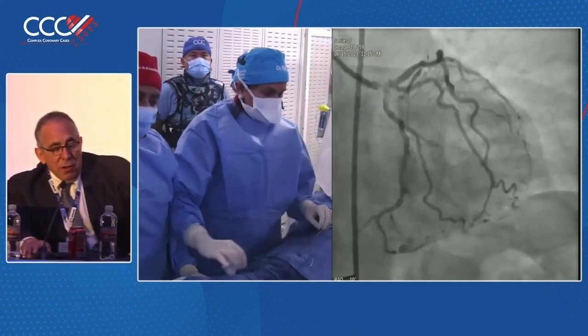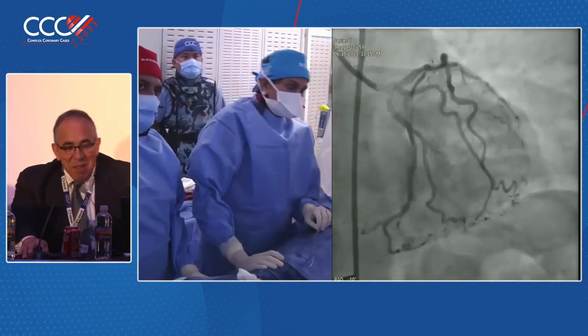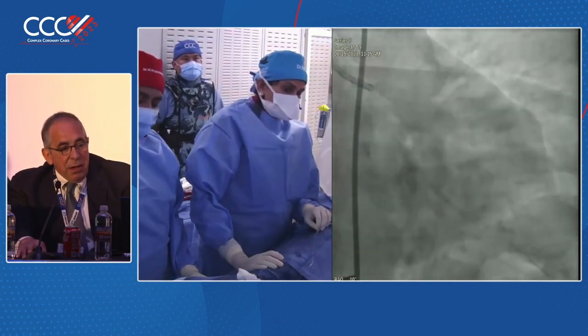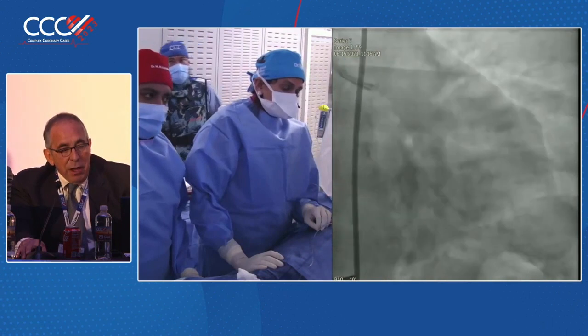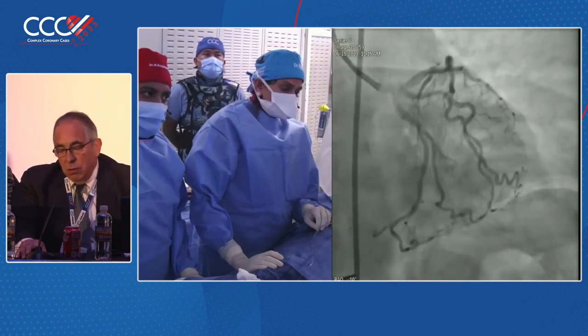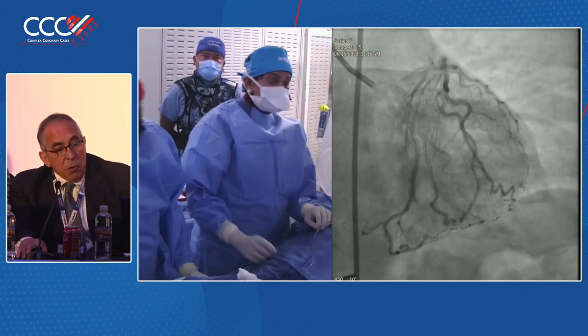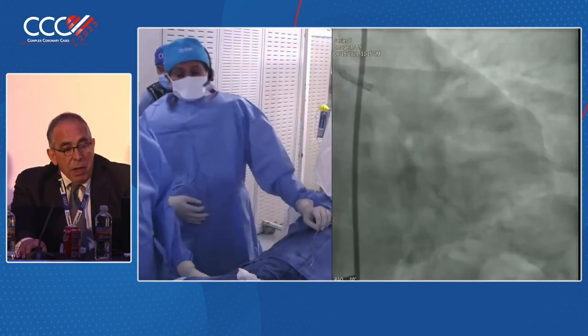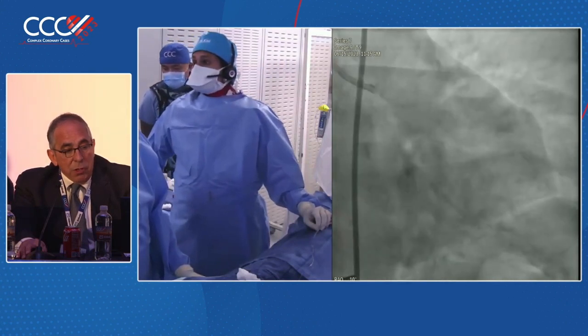I learned my lesson after the last one. I'm going to wait and see what the ultrasound shows. Usually when you have a trifurcation, at the very least you're trying to get it down to 2 out of the 3. The least burden you're going to leave alone. You may not even wire it. But I would want to see a little bit more information as to what's at the ostium of the circ.